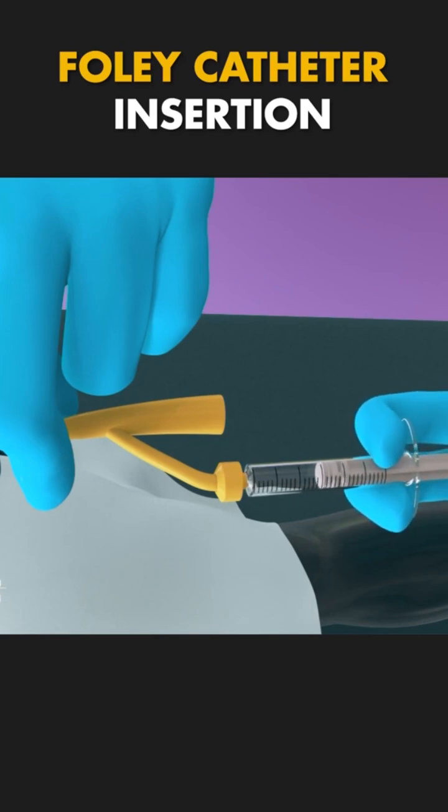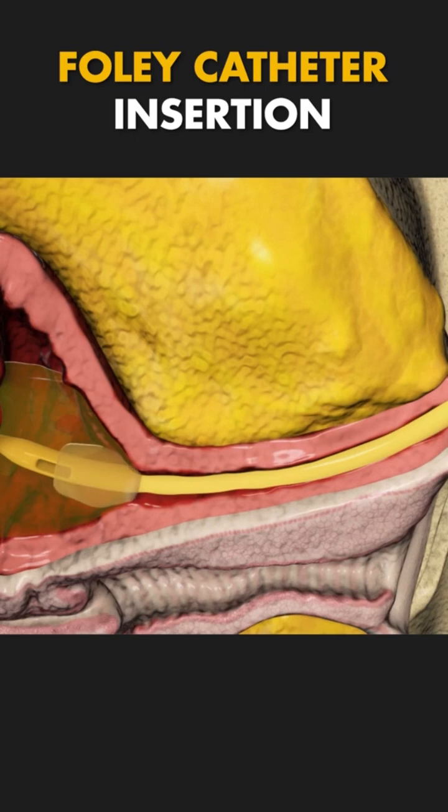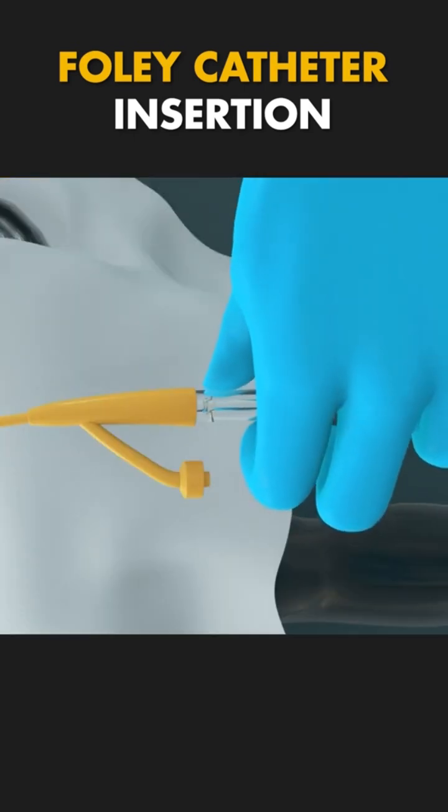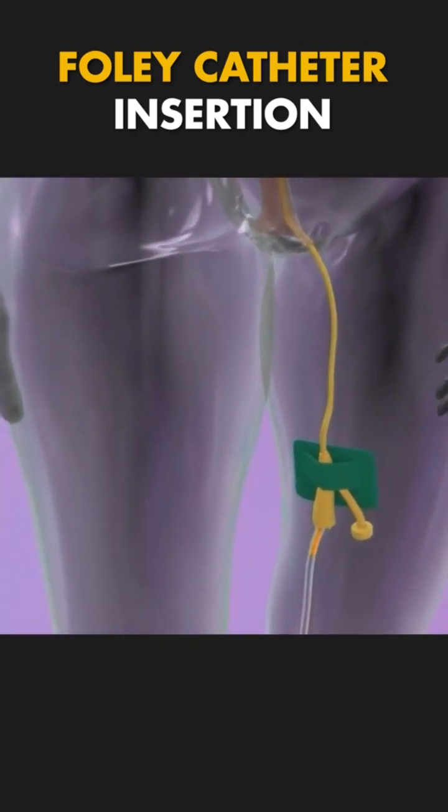Once in place, a small balloon at the tip of the catheter is inflated to keep it securely inside the bladder. The other end of the catheter is connected to a drainage bag, which collects the urine.